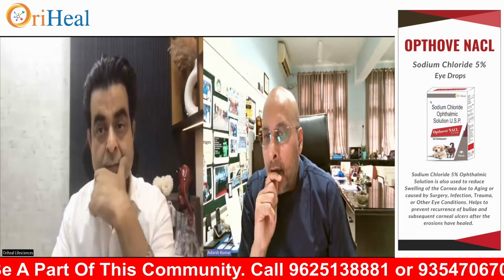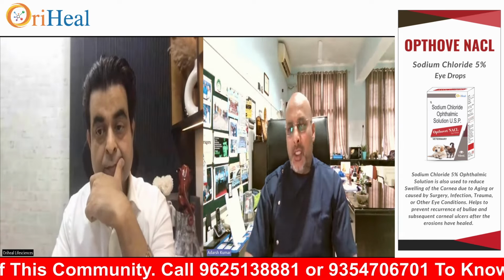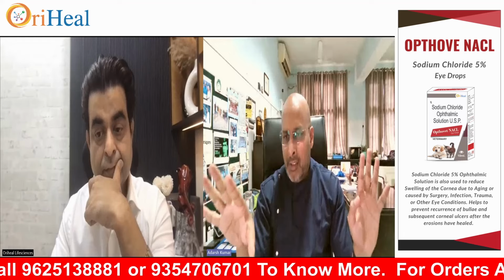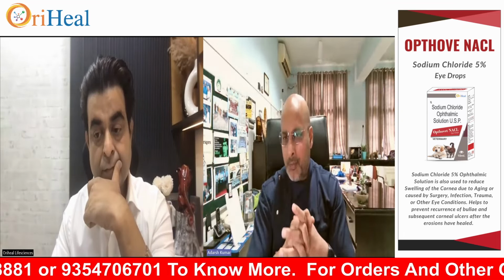So what extractions can we do under general anesthesia? Yes, you can do it under general anesthesia. If gas is not available, you can put the animal on a CRI. You can do incremental IV anesthesia if you don't have inhalant anesthesia.